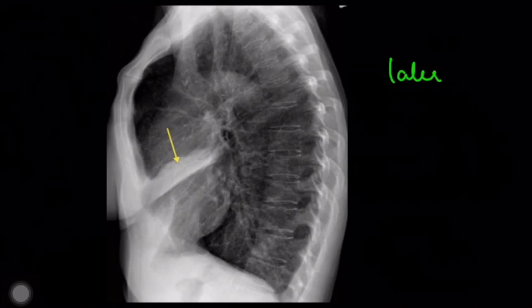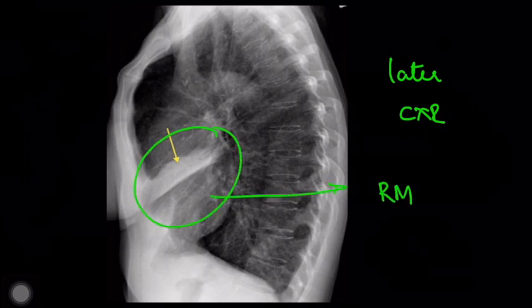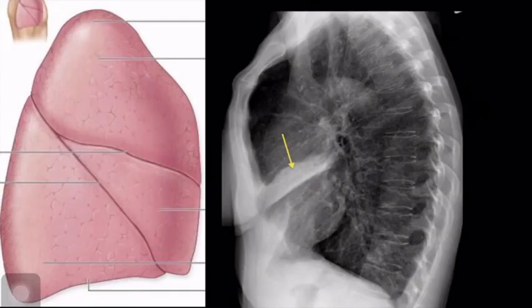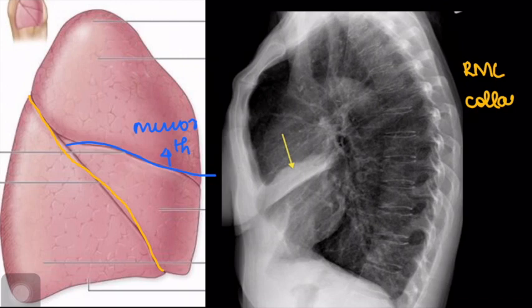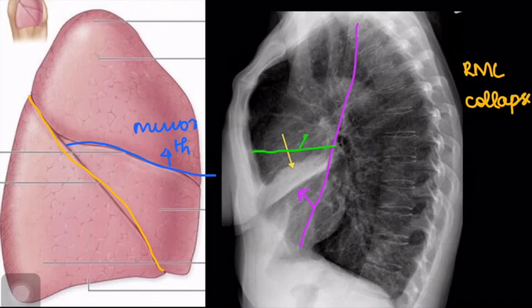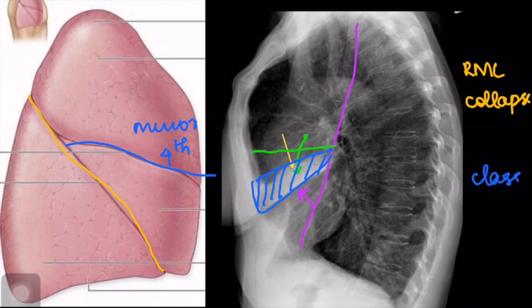To confirm the diagnosis, we go for a lateral chest X-ray. This is the striking appearance of right middle lobe collapse on the lateral view. The minor fissure is located at about the fourth rib level and the major fissure is seen posteriorly. In collapse of the right middle lobe, the major fissure moves anteriorly and the minor fissure moves downwards, outlining a wedge-shaped opacity that overlies the heart border — this is the classic feature.